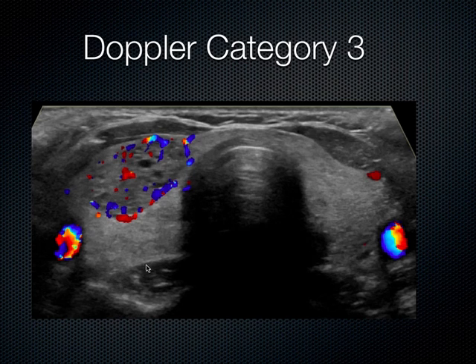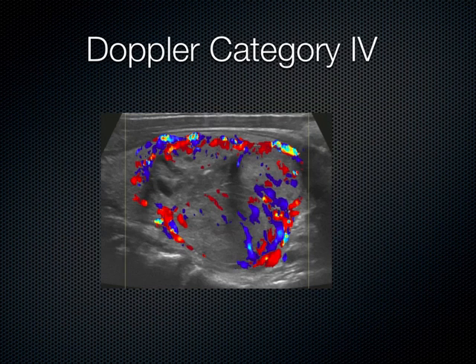And then the other part of the thyroid that appears normal is down here, but now there's this nodular component to the right thyroid seen here adjacent to the right carotid. When we put Doppler here, this is penetrating color flow with moderately rich vascularity seen there. This is category 4, high velocity color flow mapping, vascularly rich throughout this thyroid nodule down here. There's some peripheral flow as well, but this one you'd definitely want to biopsy for sure with all that Doppler flow to it.